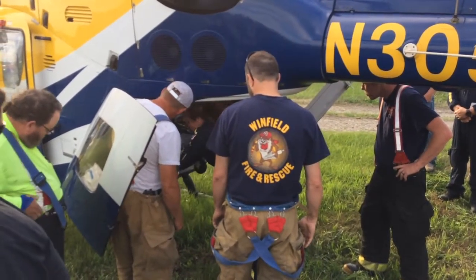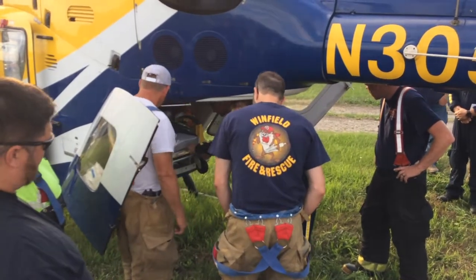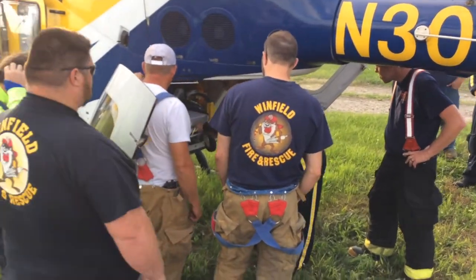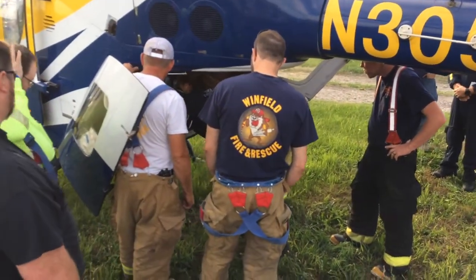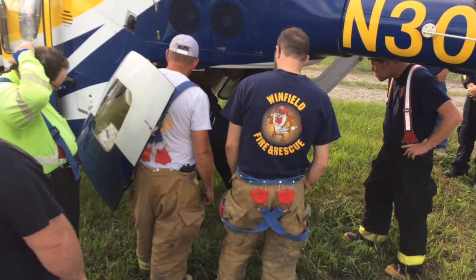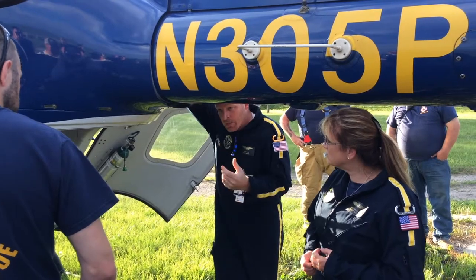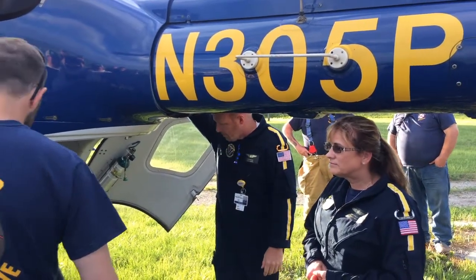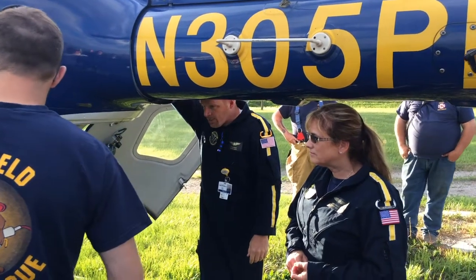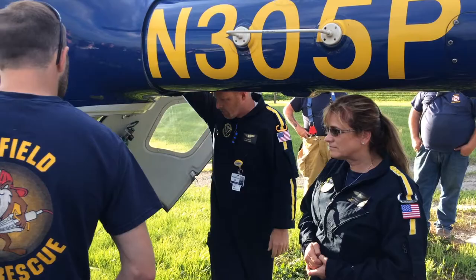Really, the most we need is just pushing it in evenly. Keep it level in your hands and it'll go in and lock. If you come up and something is on your helmet — a hard piece or anything — if you puncture any part of this, we're pretty much done. So that's the big concern with wearing helmets and getting back here: just watch your head and watch what you're doing.